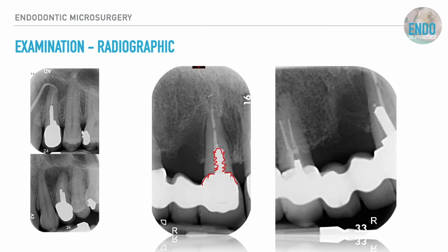so a good thing for removing it, but just from a point of view of application of forces, it's not so ideal. The obturation beyond that is okay. That little void wouldn't particularly worry me, and it's pretty much to the length of the root. The external root surface, you can pretty much trace the PDL all the way along, which is great. There are no adjacent structures, but the cardinal thing here that I'm a wee bit concerned about is the radiolucency is not apical, it's more lateral.